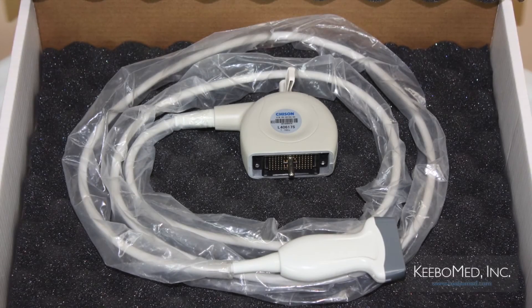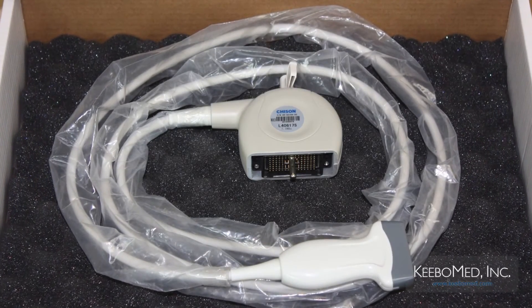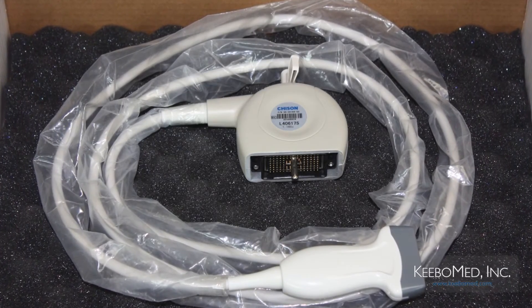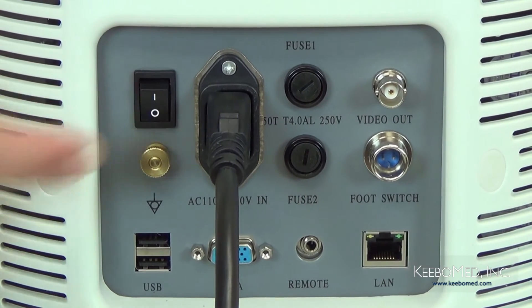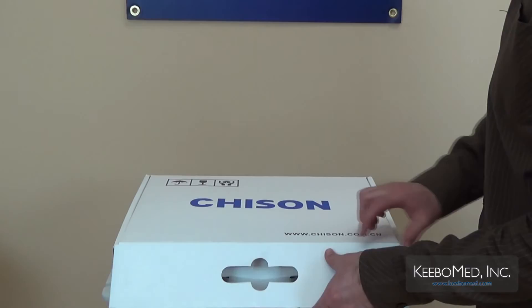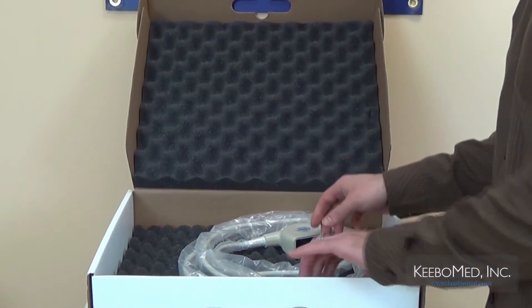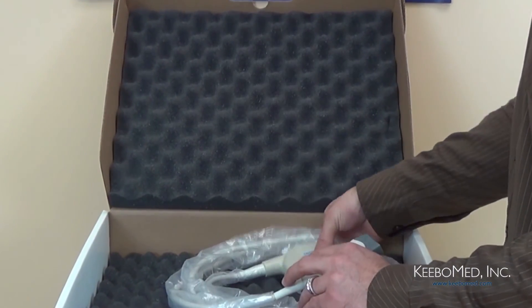Now we're going to consider the proper installation procedure of the probes. Remember, it's important to only use the probes that are provided by the manufacturer for the AD300. The first step is to make sure that the unit is turned off. Step 2, open the probe box and carefully check the probe lens, the cable, and the connector to make sure that it is in proper working condition.